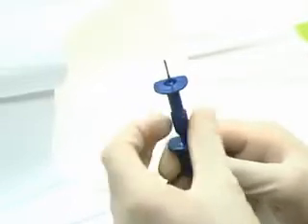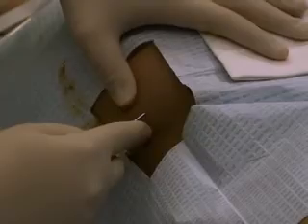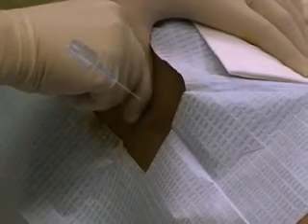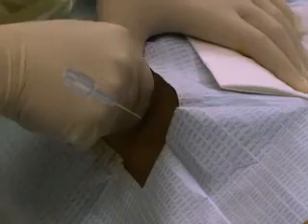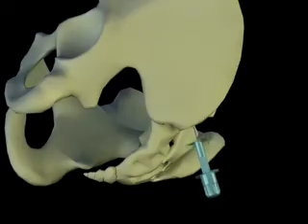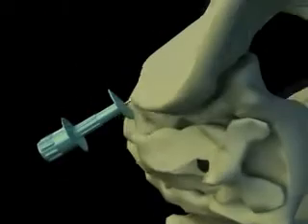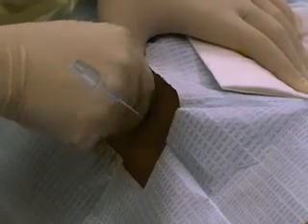Inspect the bone marrow aspiration needle and remove the plastic guard if one is present. Hold the needle horizontally and insert it into the skin over the posterior iliac crest. Advance the needle until it contacts bone. To engage the bone, the needle should be rotated alternately clockwise and counterclockwise while applying steady pressure. When the marrow cavity is entered, a sudden decrease in resistance is usually felt. The ilium is a large bone and the marrow space should be located easily; however, the angle of entry is important. In general, the needle should be advanced at an angle completely perpendicular to the bony prominence of the iliac crest.